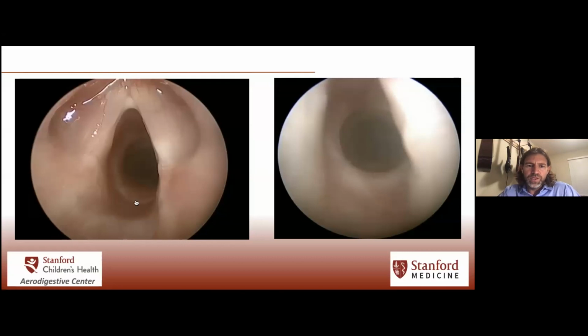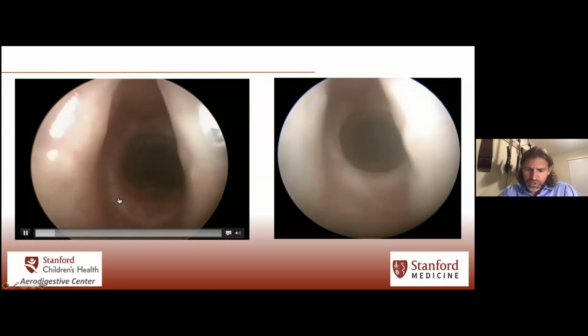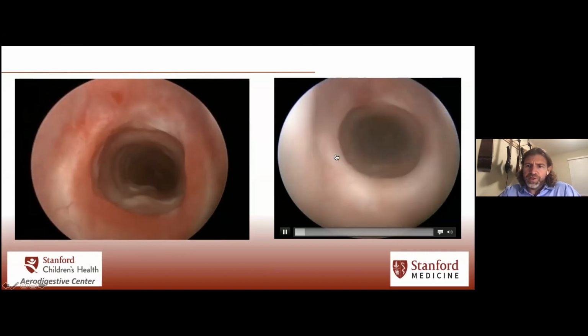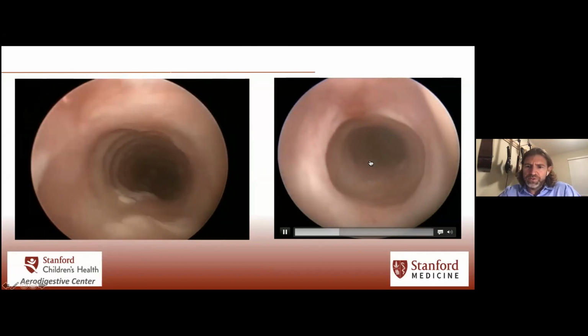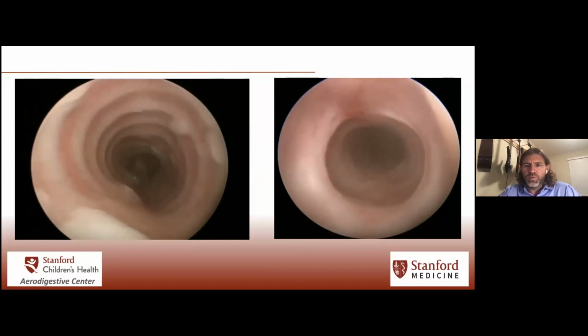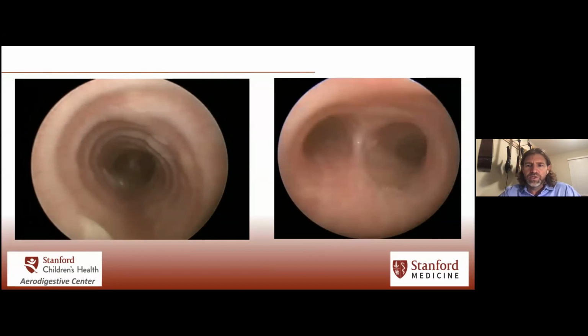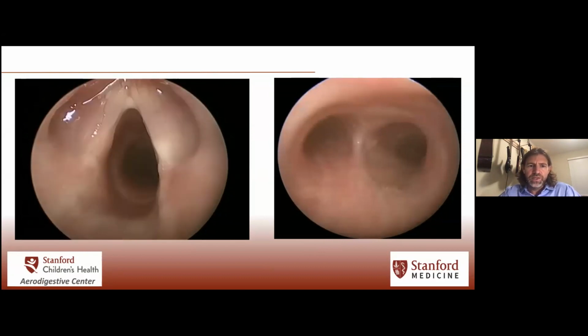And so you see in those a couple days after balloon dilation, you still have some surrounding trauma, but thereafter you actually can have a quite patent airway. Doesn't mean you can just walk away from it and pretend like you never need to see the patient again. You need to monitor their symptoms, but the balloon, again, can be very, very effective. And I think we've all seen this.